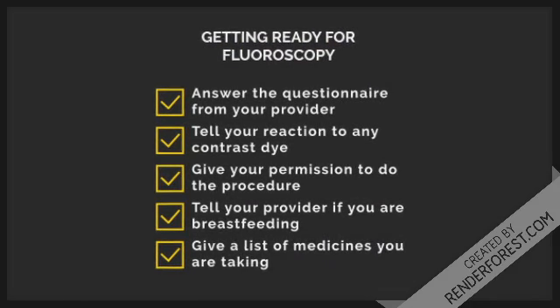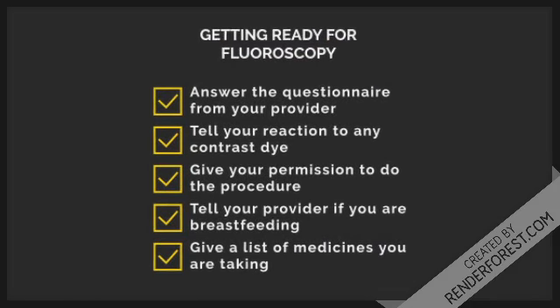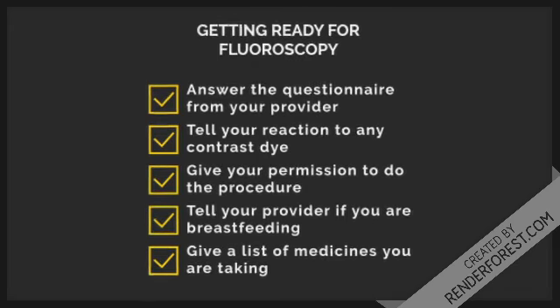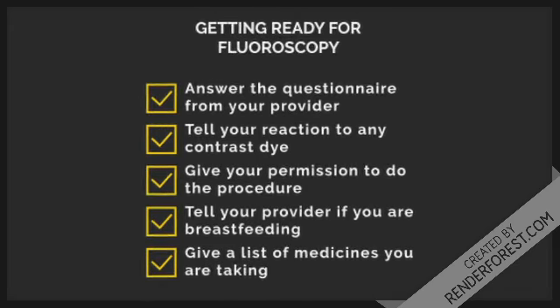In this instance, the real-time fluoroscopy may be the only method of accurately placing the needle tip within a small lesion. It also offers efficient sampling options for cortical bony lesions.